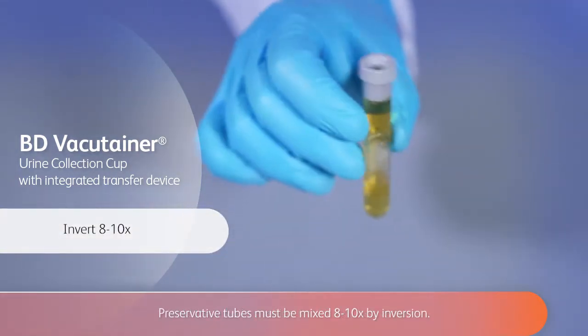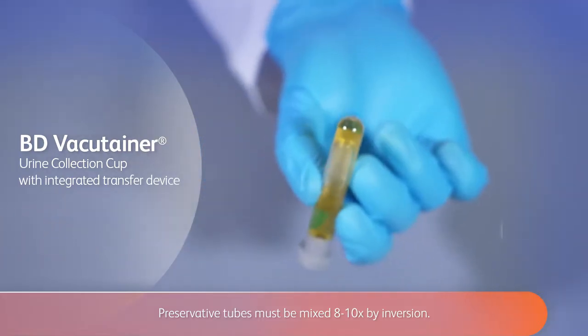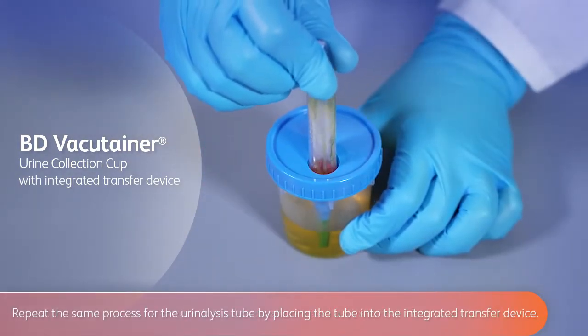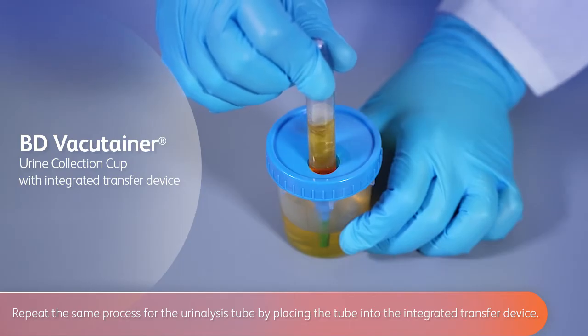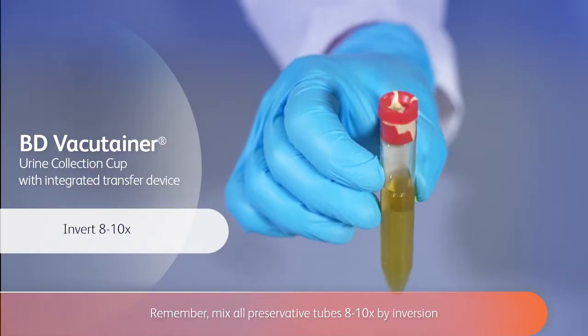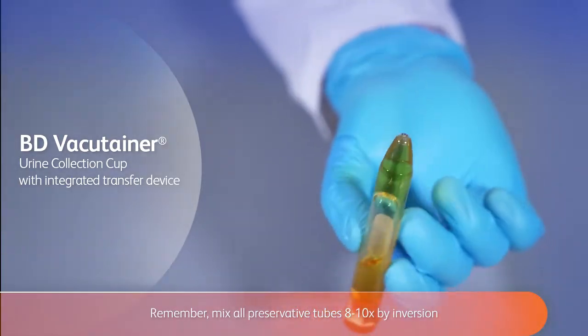Preservative tubes must be mixed eight to ten times by inversion. Repeat the same process for the urinalysis tube by placing the tube into the integrated transfer device. Remember, mix all preservative tubes eight to ten times by inversion.